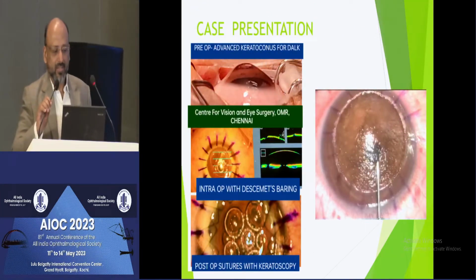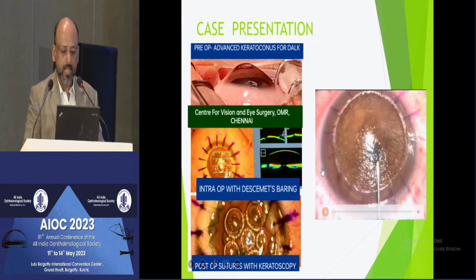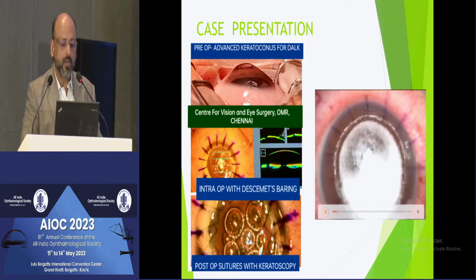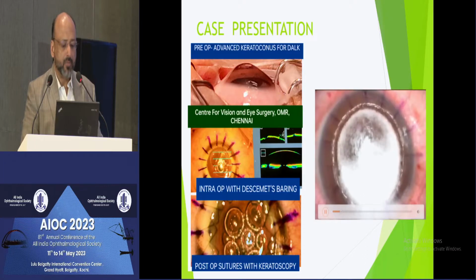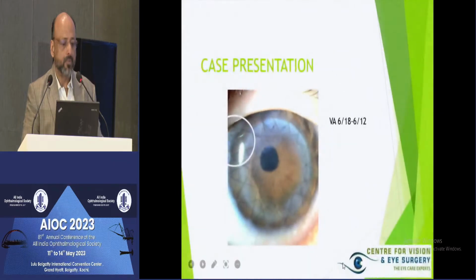All right, this is one of my cases wherein we did a DALK with the big bubble technique, and intra-op we were able to bare the Descemet's, and post-op the sutures were in place. Post-op, I realized there was an area of edema. Since the vision was very good, we decided to just leave it and observe.